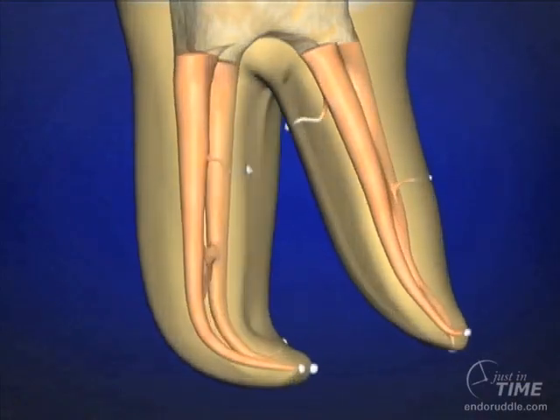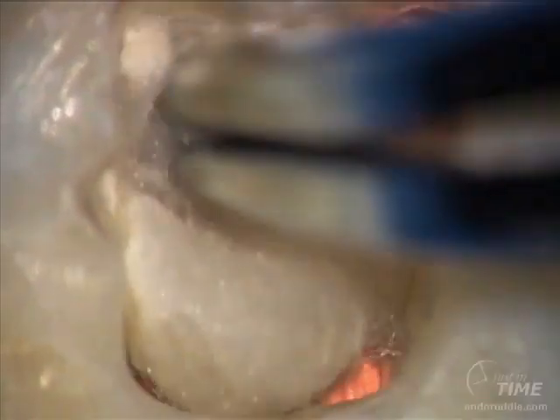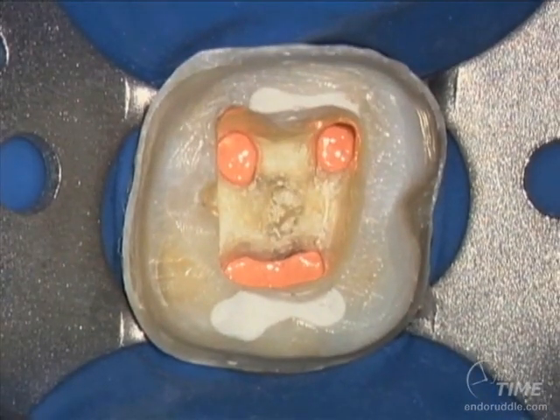Now that we're done, we can appreciate through an animation what we just accomplished. More importantly, we can use a solvent on a cotton pledget to clear out the pulp chamber, removing remnants of gutta percha and sealer from the floor and axial walls. We then chase that with 70% isopropyl alcohol to remove any residual precipitates of chemically softened gutta percha or sealer, allowing any dentist to begin thinking about adhesion dentistry and fulfilling the rest of the seal.